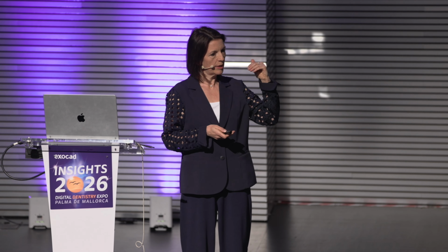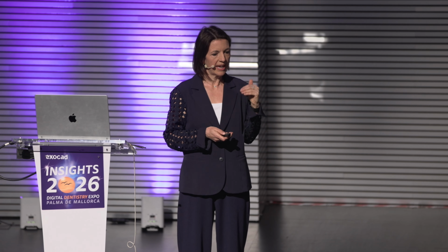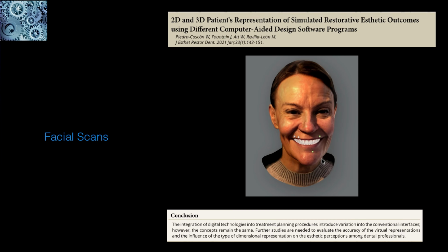And these have a place, and I think one of the slightly challenging things that we have is different tools work in different cases. And some dentists might want to take control of imaging by themselves. Others will prefer to outsource that. We're not CAD designers generally. We haven't learned how to do that. Then we've got other tools like facial scanners coming in. And I think these are not patient friendly. They're helpful for our understanding and imaging, and we can see in the profile, which we can't see from any other source, but generally we don't want to show patients images like this and think they're going to be motivational, because they're not.